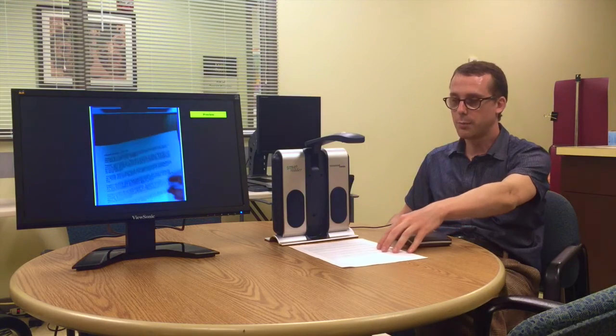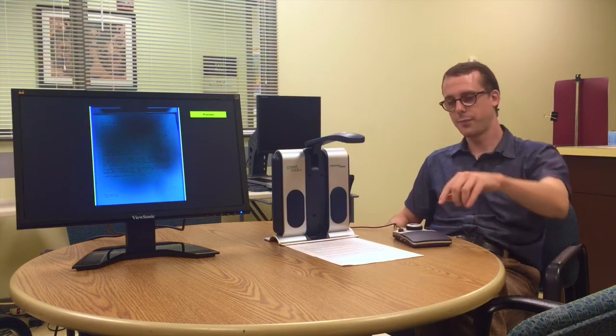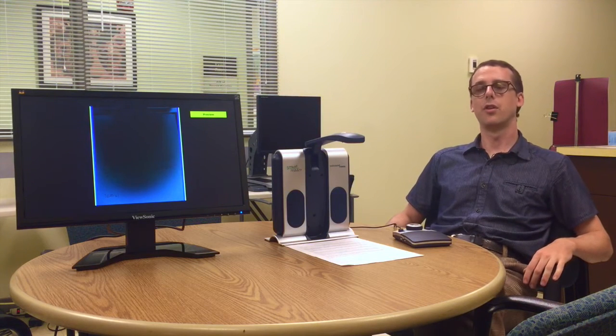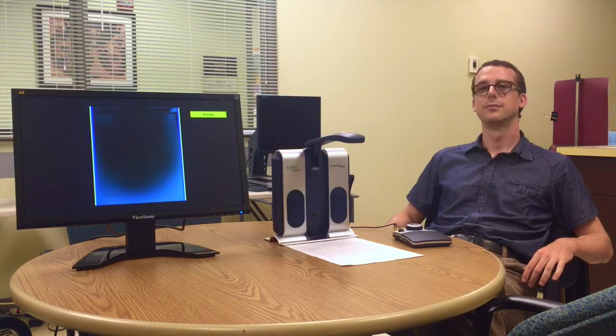In order to use it, we can place our document underneath it, and press a button on the control panel, and it will take a picture of the document. After it's taken the picture, it will process the image, and then it will start to read to me.